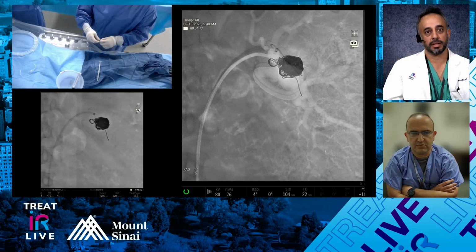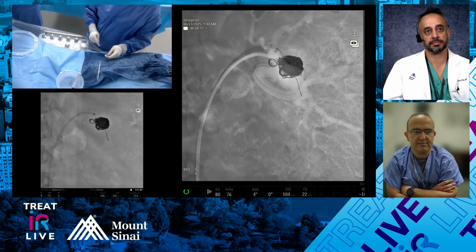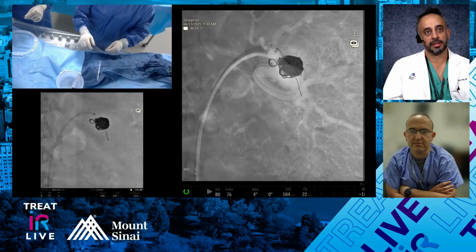What do you guys do? This is also, by the way, a very good sign. Before, we wouldn't have any backflow of blood. Now we do. So to me, that's a very good sign that we're towards the end.